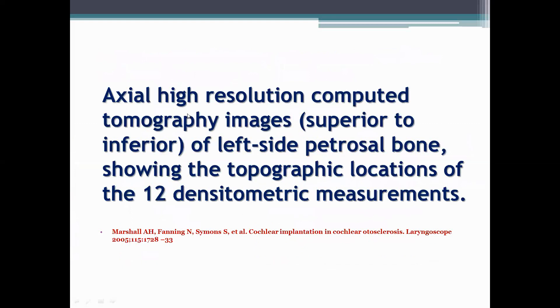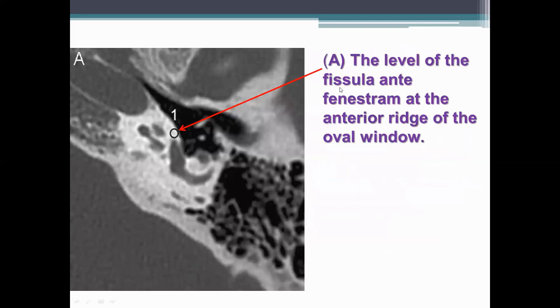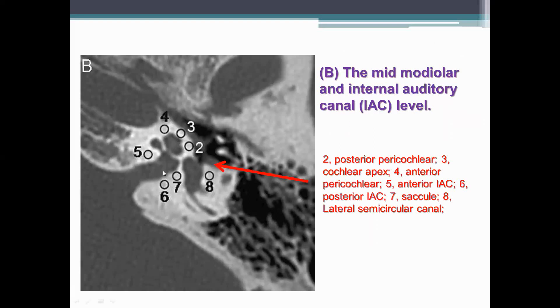These are axial high resolution computed tomographic images from superior to inferior of the left side of the petrosal bone, showing the topographic location of 12 densitometric measurements. At the level of the fissula ante fenestram, area 1 is at the anterior ridge of the oval window. The second area of interest is the mid-modiolar and internal auditory canal level: area 2 is the posterior pericochlear region, area 3 is the cochlear apex, area 4 is the anterior pericochlear area, area 5 is the anterior part of the internal auditory canal, area 6 is the posterior part of the internal auditory canal, area 7 is the saccular area, and area 8 is the lateral semicircular canal area. These areas must be examined for foci of otosclerosis.